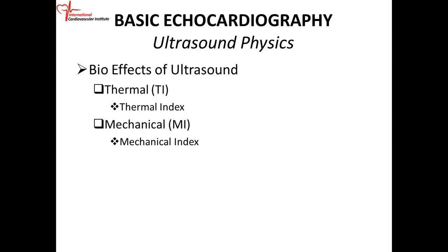So ultrasound is very safe. However, where you have rapidly dividing cells, it can cause some problem. Okay? So it's relatively safe, very safe in adults, but in the developing fetus, it can be a problem.